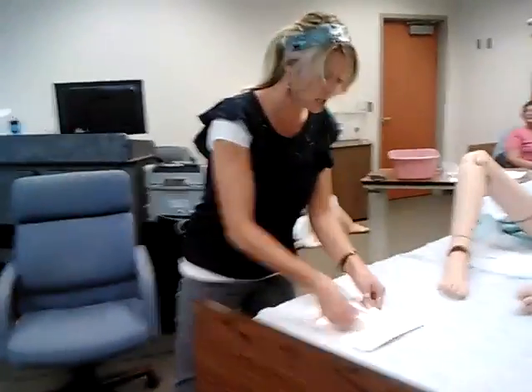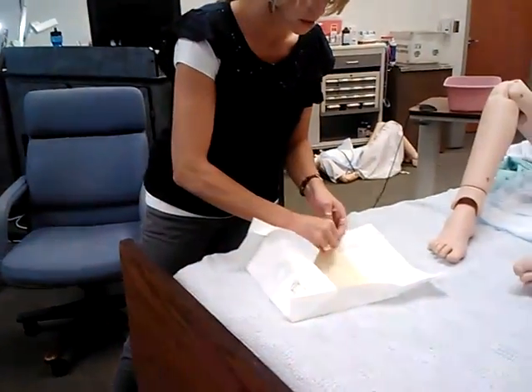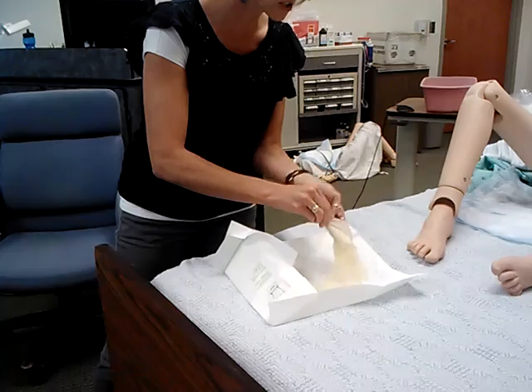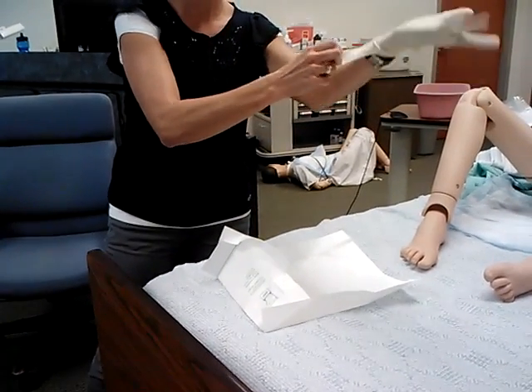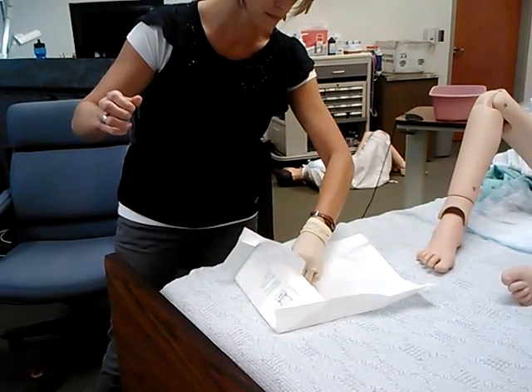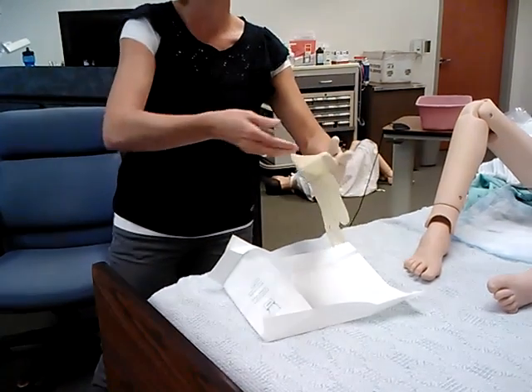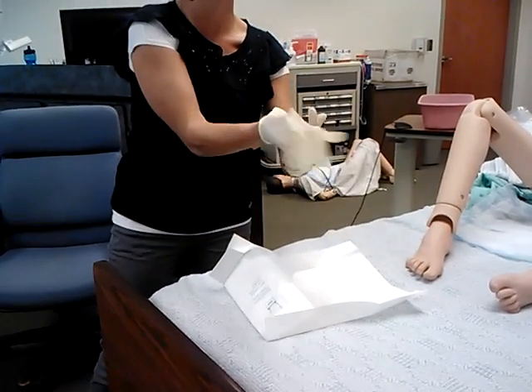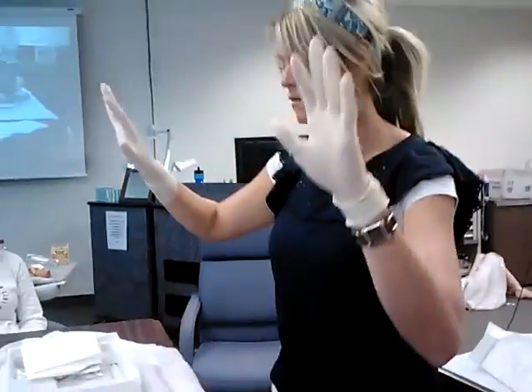You guys know how to put sterile gloves on. Okay. Then you put your sterile gloves on. Move faster and it doesn't squeak if you move faster. I need to work on that for this one. So do I. Okay, you got your sterile gloves on.